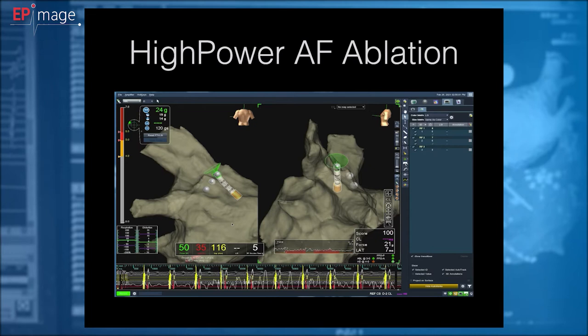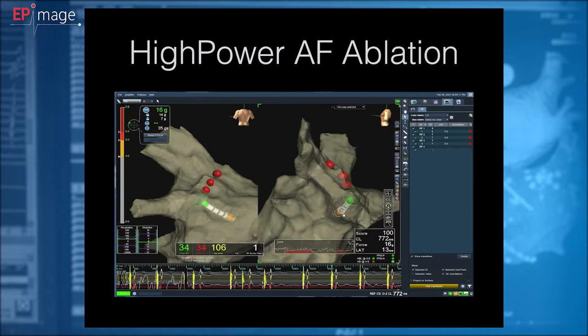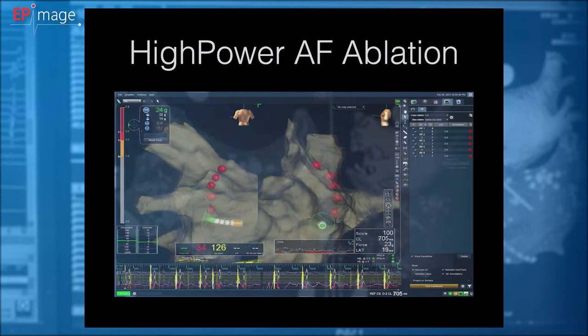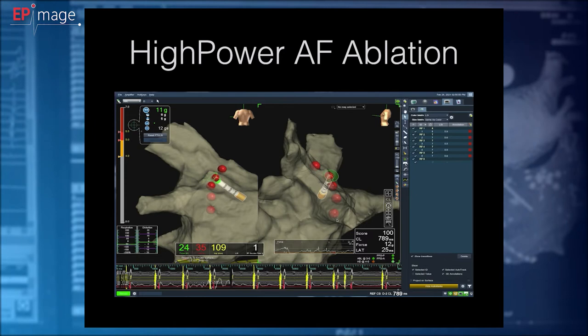The important thing is to keep contact force at least 10 grams at its minimum and not to cross 30 grams. Above 30 grams you have no additional value, and in fact the lesion will be narrower and shallower. And that's not what we intend. So with high power 50 watts, it's good to keep contact force between 10 and 30 grams. You may be surprised that I'm jumping on a posterior wall. That's for purpose.